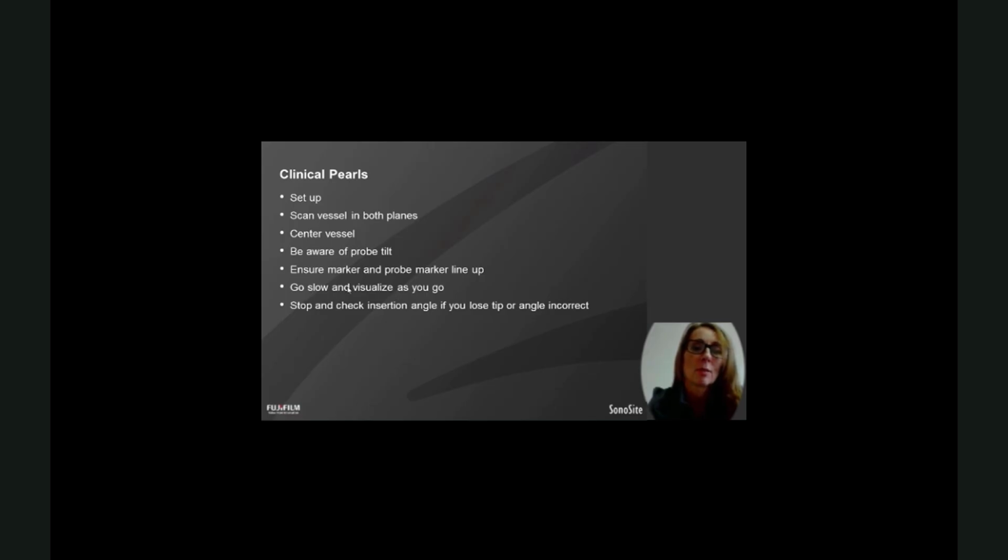It's worth the effort. The other thing is, just don't set your staff and your patients up to fail. Give them the training. Take that little bit of effort. Remember that it is a new skill, that even though you may have some of the best expert cannulators and expert clinical assessment staff in your unit, that doesn't mean that they don't still need to be supported and trained in this new skill. And they shouldn't be hard on themselves and expect that they can do it. It should just be an expectation that this will require extra training. So have a really good competency assessment package in place.